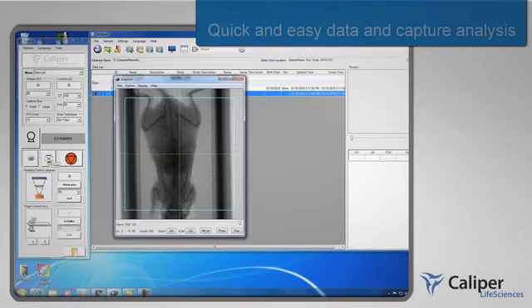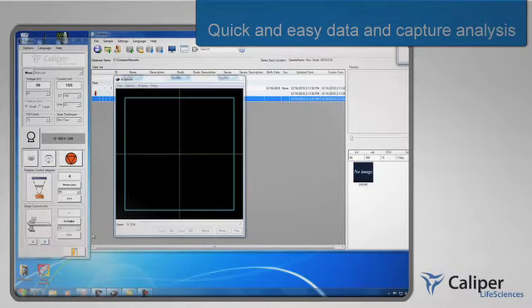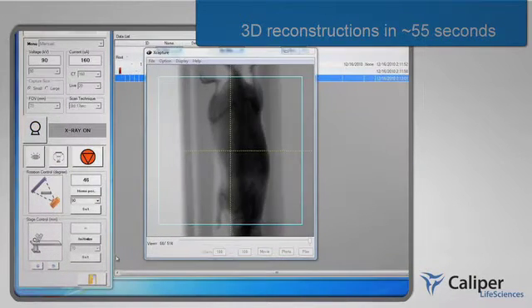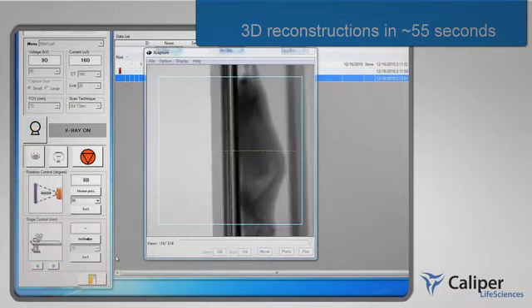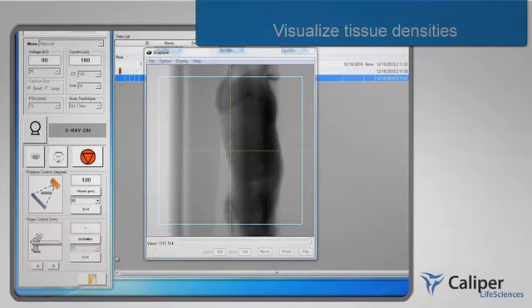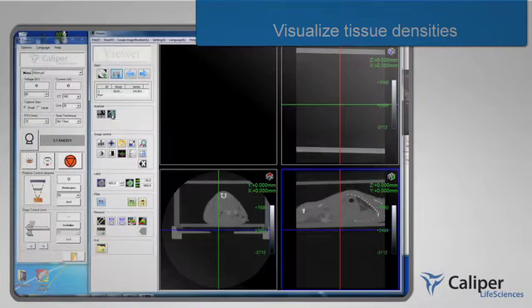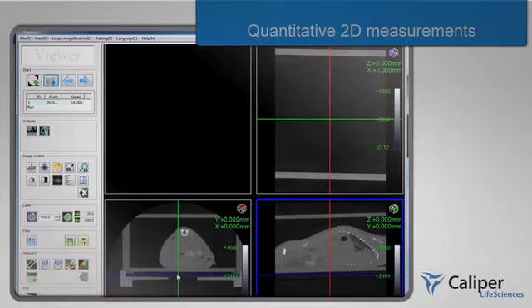Data capture and analysis is quick and easy. With 3D reconstructions in about 55 seconds after scan completion, basic analysis tools allow you to visualize tissue densities and make quantitative 2D measurements.